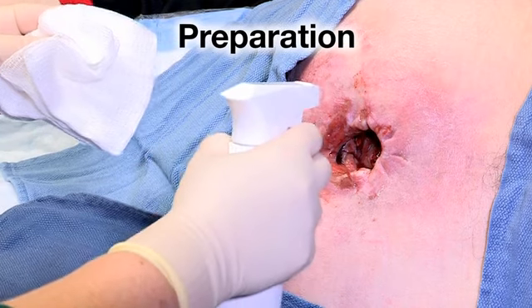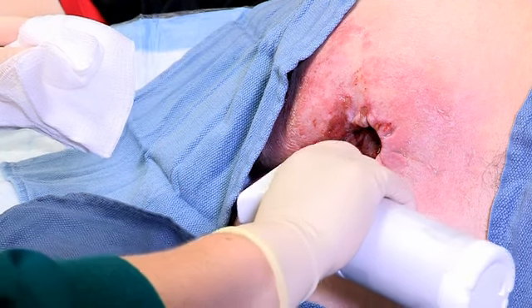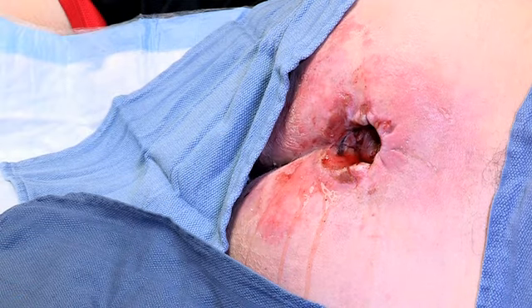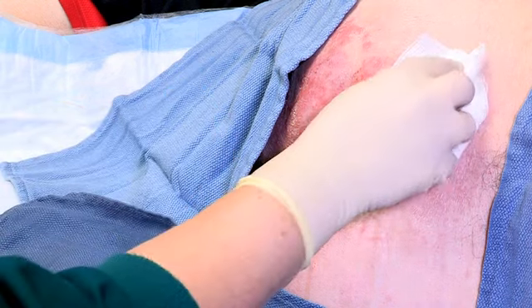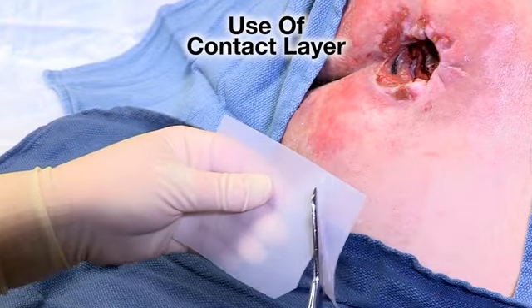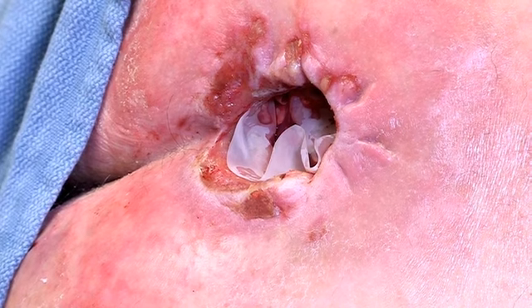Make sure to properly assess, cleanse, and prepare the wound and peri-wound skin prior to proceeding to the dressing application. The wound assessment and preparation chapter in this video provides information on completing these steps. Do not use oxidizing agents such as hypochlorite solutions or hydrogen peroxide prior to the use of the Avance foam dressing. Once the above has been completed, proceed to the next steps. When applicable, protect bones and tendons with a wound contact layer. Document the number of wound contact layers used in the wound.